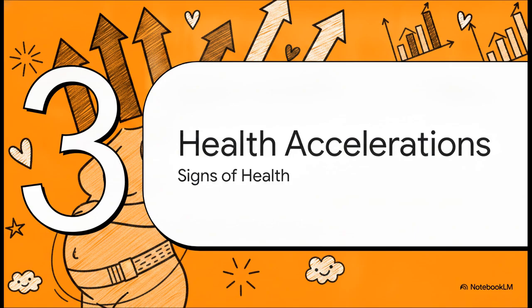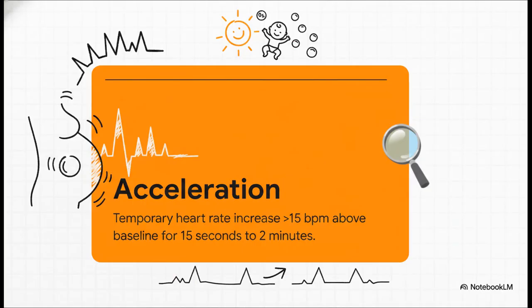Section 3, Accelerations or Signs of Health. Let's shift our focus back up to the baby's heart rate. And we can take a breath here, because an acceleration is a wonderfully positive sign. Officially, an acceleration is defined as a temporary increase in a term fetus's heart rate that's greater than 15 beats per minute above the baseline, lasting for at least 15 seconds, but no more than 2 minutes.